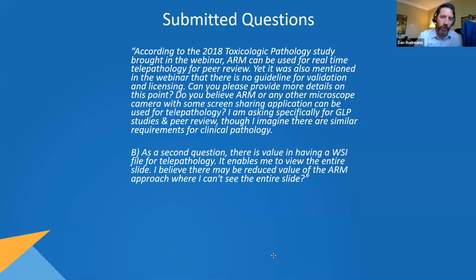But that's really the powerful thing about it, because the pathologist will get to the area of interest through their training and experience, where they want to use the ARM to help them make a decision. So let's say you have a whole slide image and 95% of it, who cares what the artificial intelligence thinks about, because it's just normal. And there's only 5% of that huge file that really is of interest that would really help the pathologist make a decision. So someone could argue that other 95% is just wasted time and energy, right?